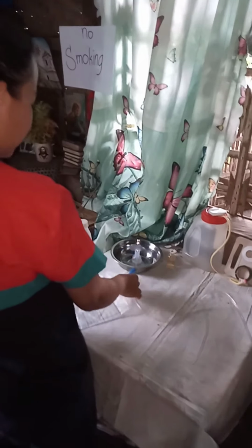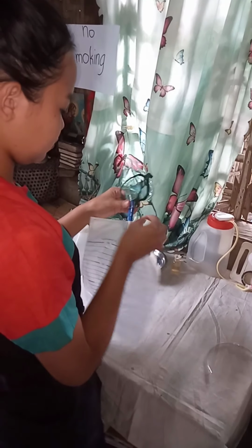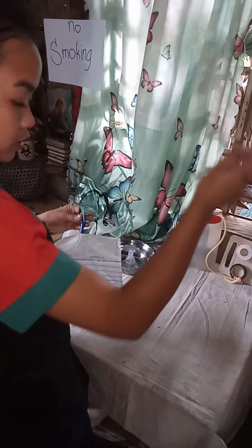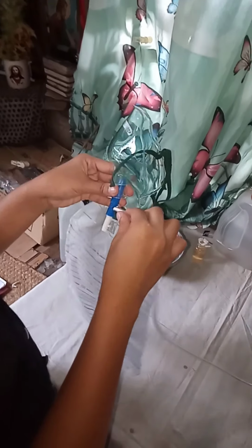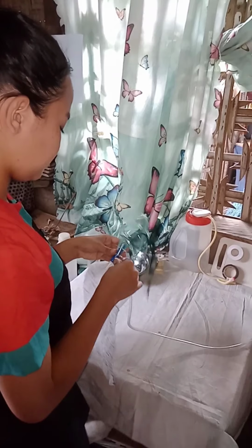Then attach this without the valve. Then it is time to attach this oxygen tubing here. Then turn on the prescribed flow rate. In this case, we need 8 to 16 liters per minute.